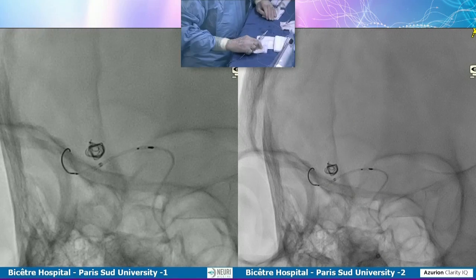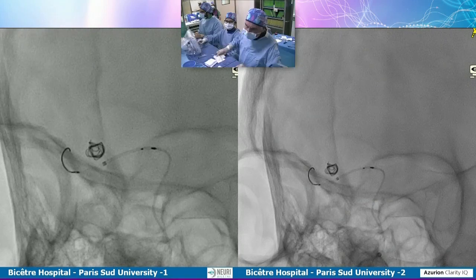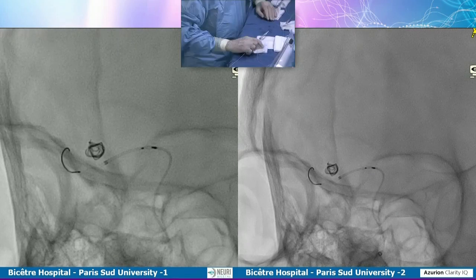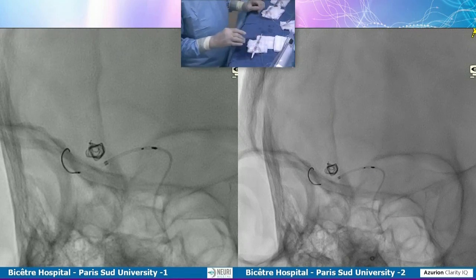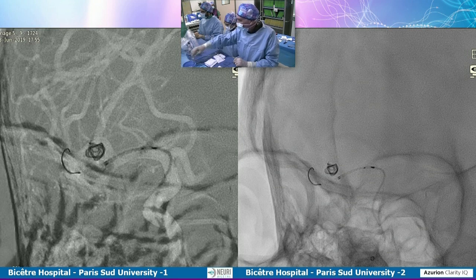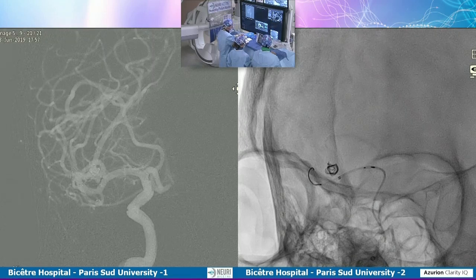Then you have a mesh density. You have to change the scale by pushing on that button, so they didn't push it. And depending on the compression, of course, you are changing the porosity. I never know, you compress and the porosity is decreasing. So with this, you only simulate those things. You don't simulate the flow itself.